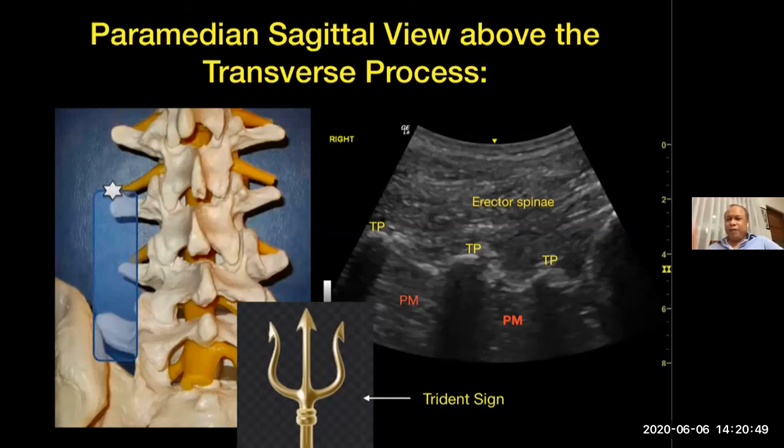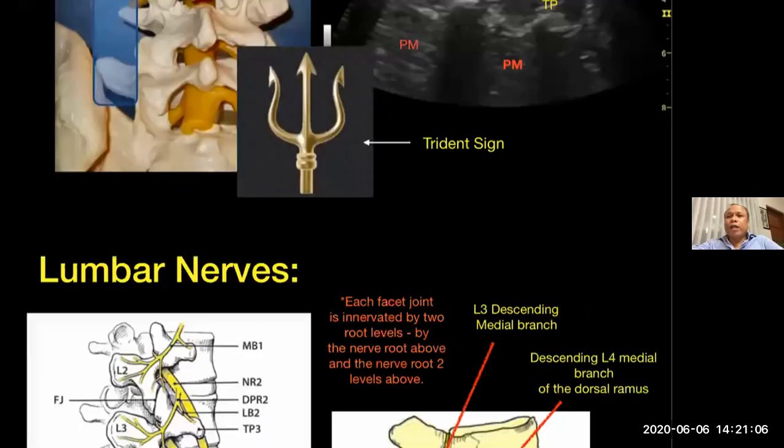Now, if you look at the lumbar spine, it's very easy to check the structures because you can almost always just look at the pattern, and then you would be able to see what particular structure you're looking at. So this is just the way we would like to scan the spine.